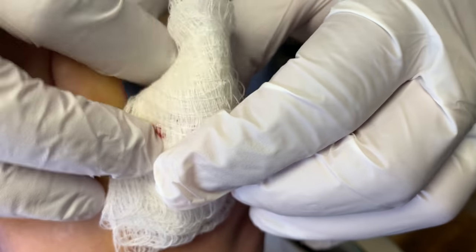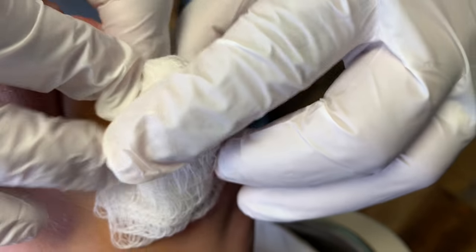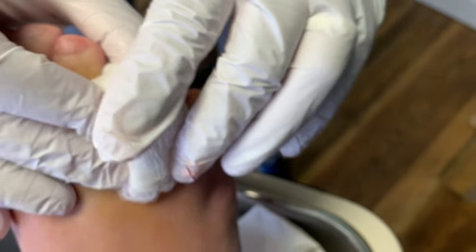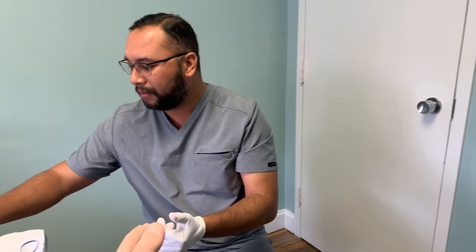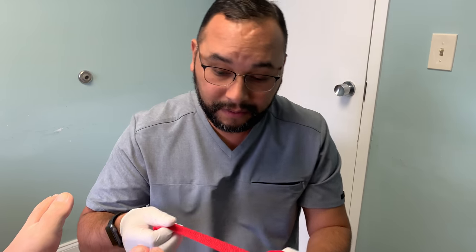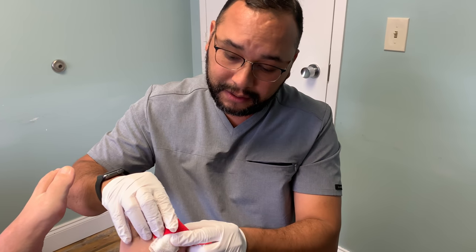So that's it. We're going to cover this up with some Adaptic, and then we're going to get the patient out of here and they're going to have a pain-free toe. Dr. Cruz, another successful avulsion. This one was pretty easy — fourth toe. Smaller toes are usually pretty easy compared to the big toes. But again, the relief is going to be very good for this patient.